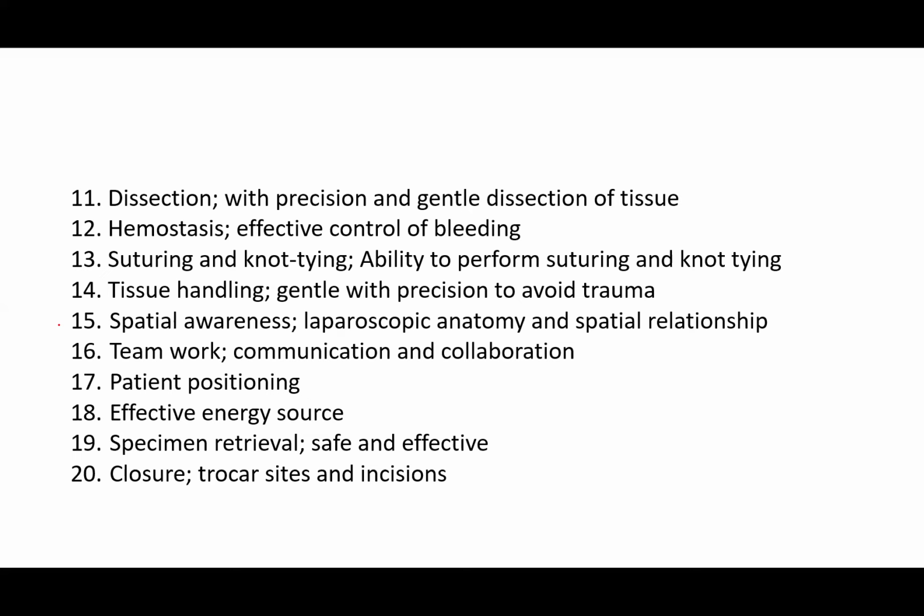Teamwork: you should communicate effectively with other members of the team and collaborate. No member should frustrate a laparoscopic procedure. Your entire goal should center around the patient and how to achieve a better outcome. Next, patient positioning.